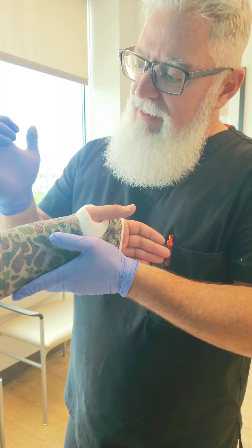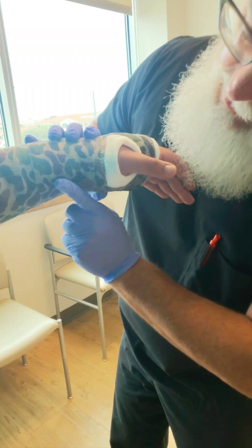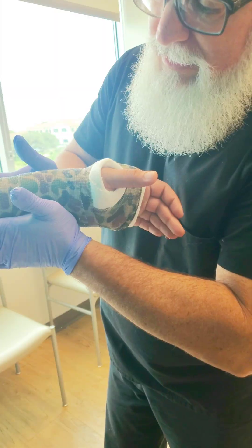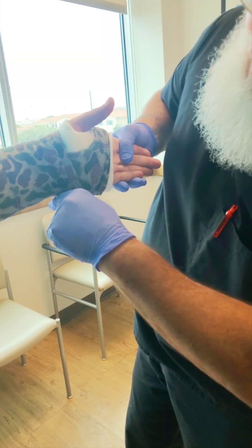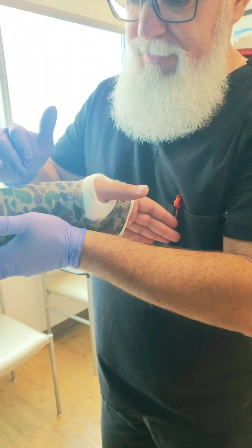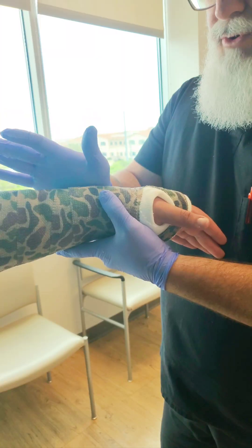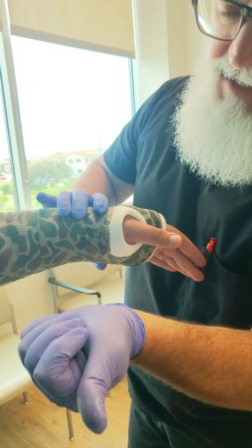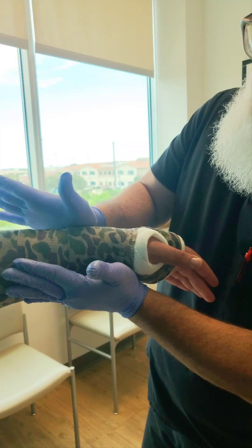Use open-handed technique — use the flat surfaces of your hand to make your molds. I'll turn it so you can see: here is the interosseous mold, here is an ulnar deviated mold, and here is a volar mold. The only mold we didn't put in here is what we call a dorsal mold — a dorsal mold is the exact opposite. Instead of having the meaty part of your thumb on this side, you'd have it on the other side in the same cupping position.